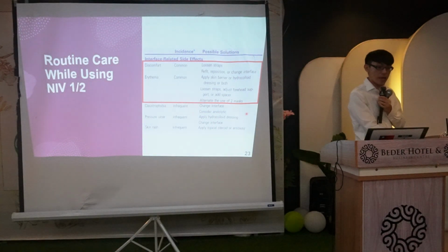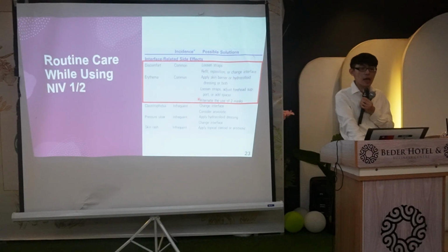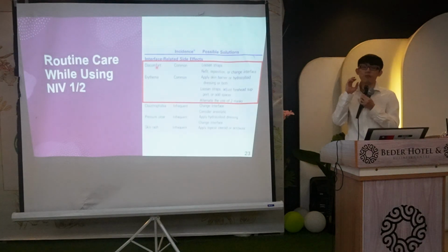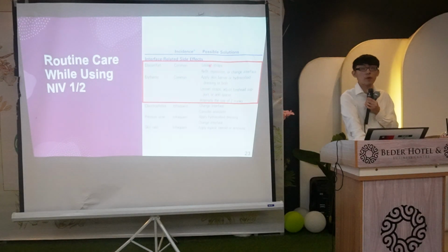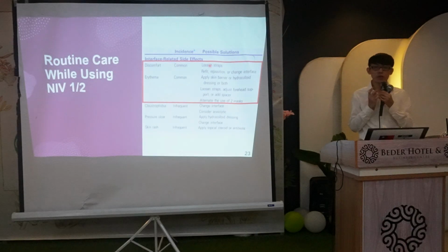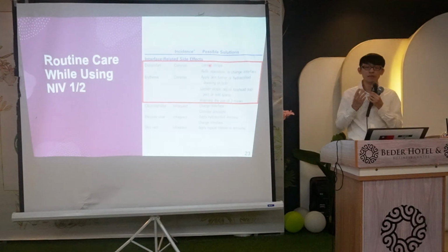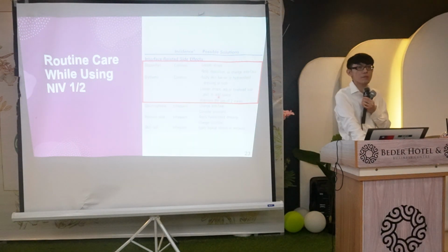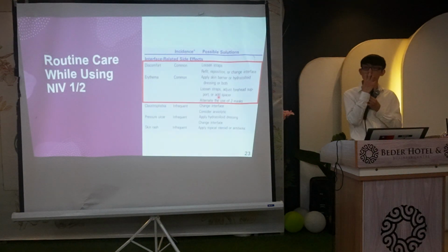And another thing is care for the BiPAP or CPAP patient. A common problem is discomfort, or what we call pressure sore on the face. Okay, so you need to loosen the strap. We can accept some leakage, so do not wear the mask too tight. Okay, we can accept some leakage. So just loosen the strap or change. Sometimes we will shift to another mask. Maybe the patient uses a full face mask and we can shift to another one, maybe just a nasal one.